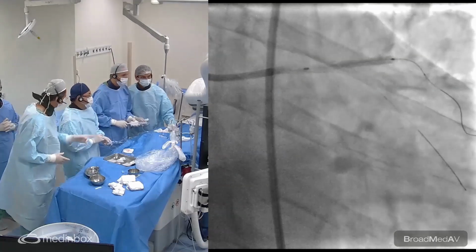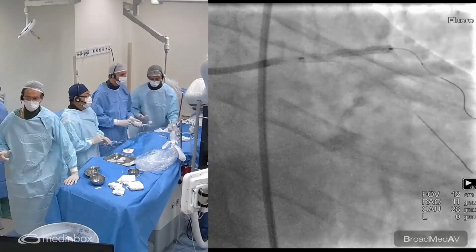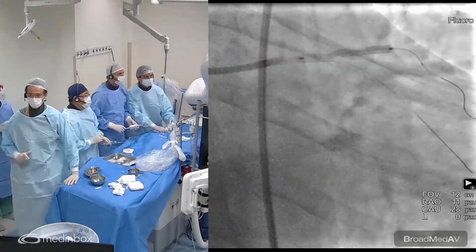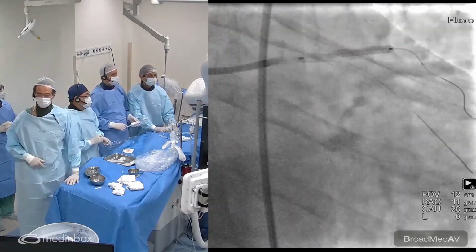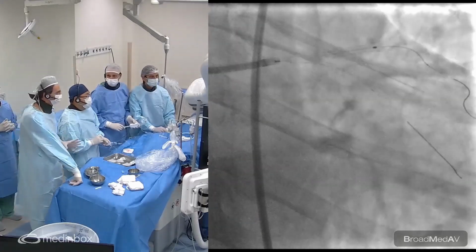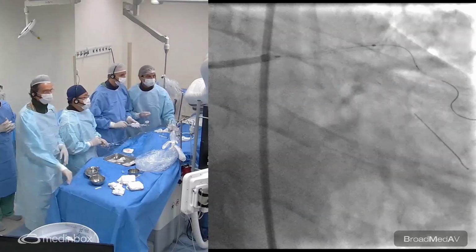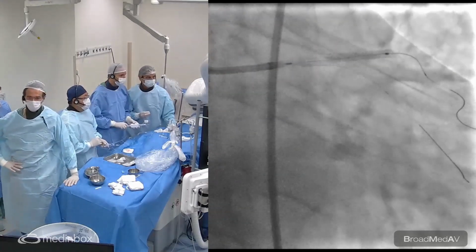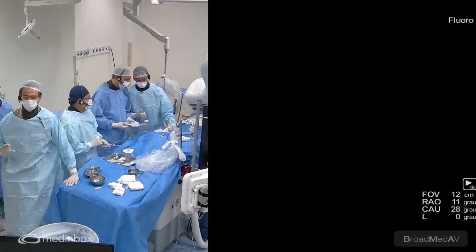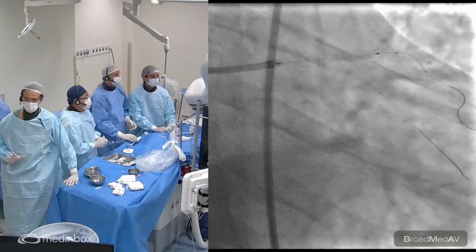Wait. We are up to eight atmospheres, just because of the distal. There's some calcium in the lesion. You see some constriction at the balloon. So this is a 3.0, and the left main is about 4.0. 4.5 by eyeballs. So now I pull back a little bit, 2 millimeters. Okay, pull back the balloon. We are not touching the wall in the left main because it's a 4.5 and this is a 3.0 balloon.